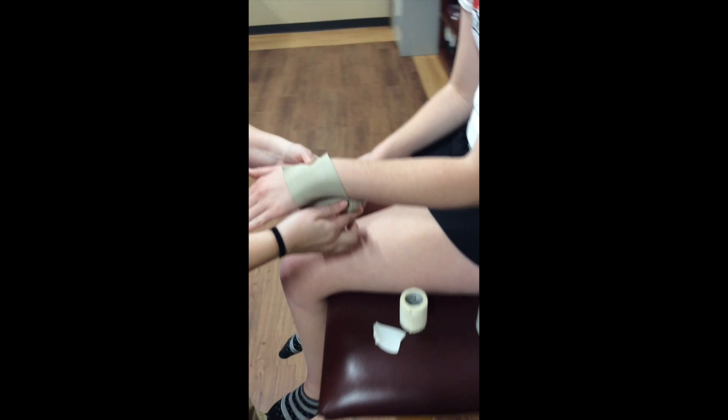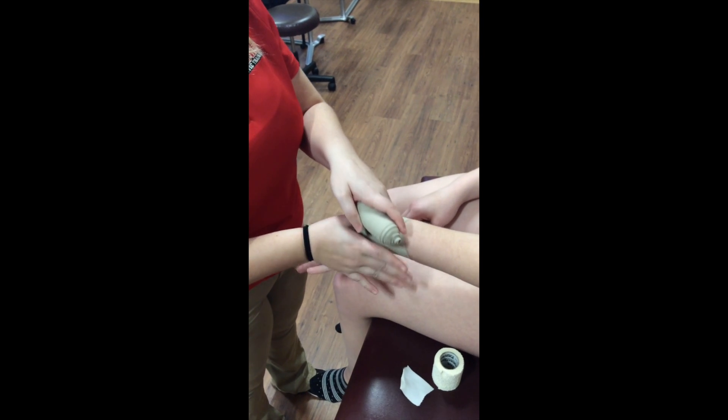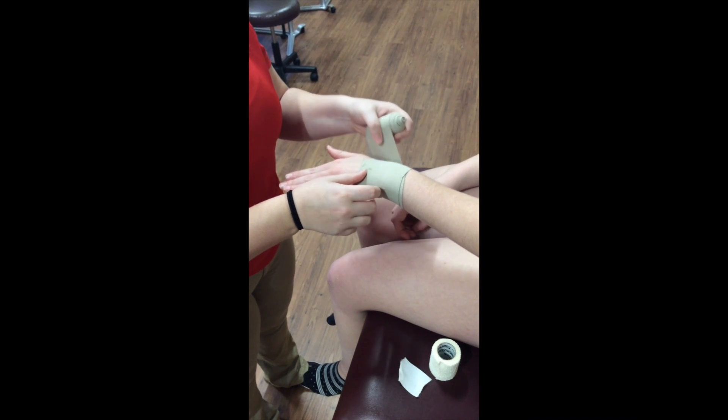The athletic training student begins the wrap on the distal wrist and wraps approximately two times around the wrist.